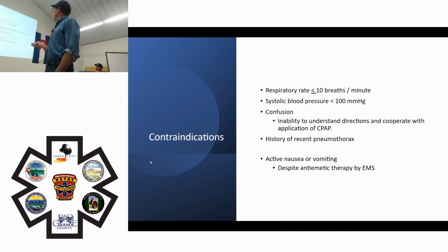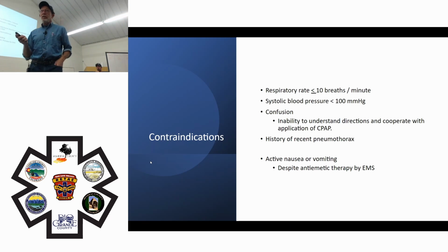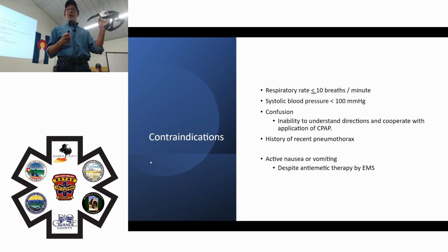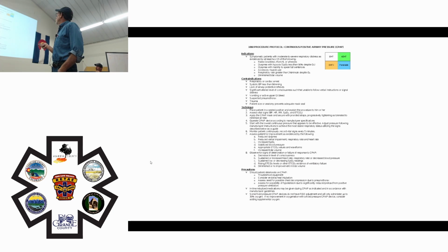Nausea or vomiting is a relative contraindication because, as you'll see in a minute, this mask is going to be strapped tightly over their face. That could be a difficult problem. So, what does our procedure say for CPAP?